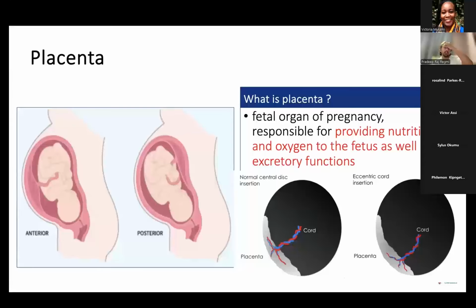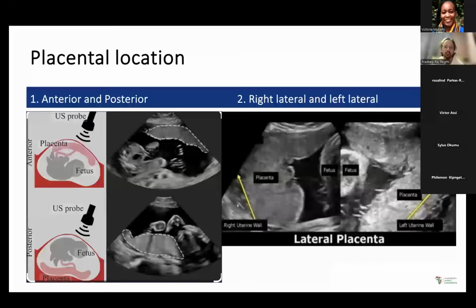The placenta is quite important, and I am giving emphasis on the placenta because it can definitely help reduce fetal mortality in the periphery. With a midwife doing the ultrasound, sometimes it is harder to get the whole length of the placenta. So the devices can help localize the placenta, so that the peripheral midwife can refer patients in time to the tertiary center.